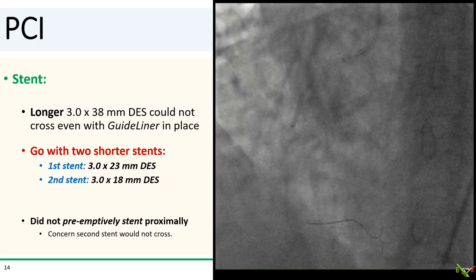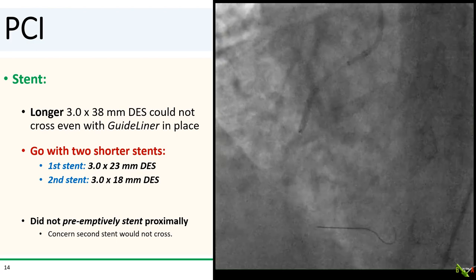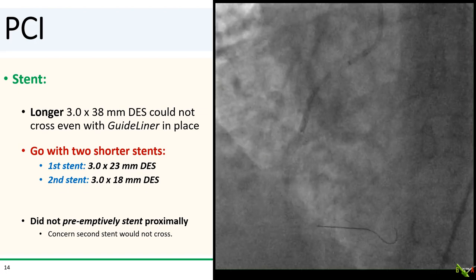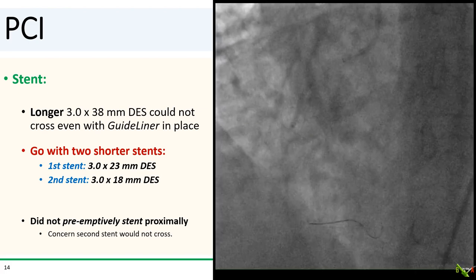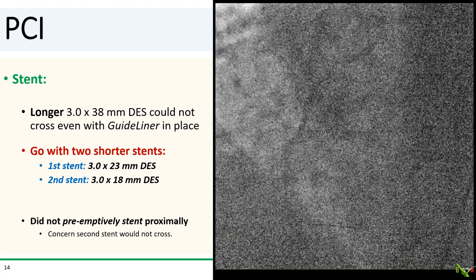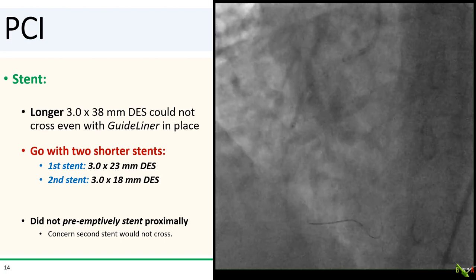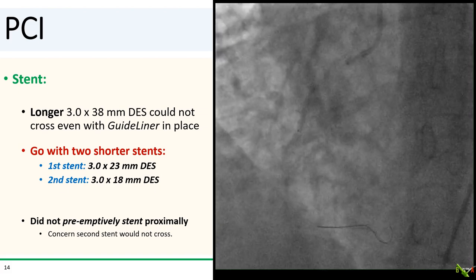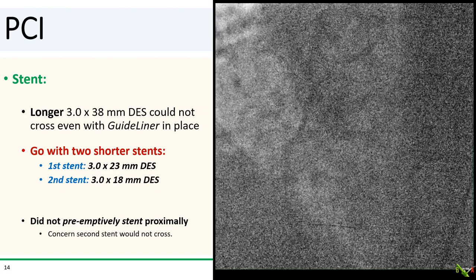So let's stent this up. We initially chose a long 3.0 by 38 mm DES, but the long stent could not cross even with a guideliner in place. Instead, we used two shorter overlapping stents, which did successfully cross. We actually thought about placing the proximal stent first to prevent back propagation of the dissection, but we ended up stenting distally first because we were concerned that we would have difficulty with the second stent crossing.